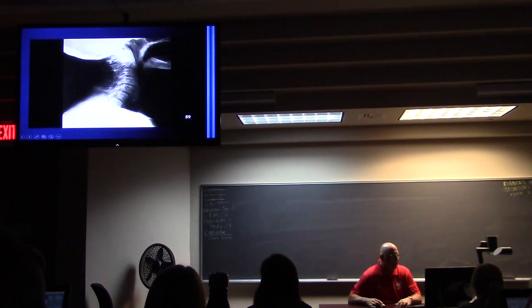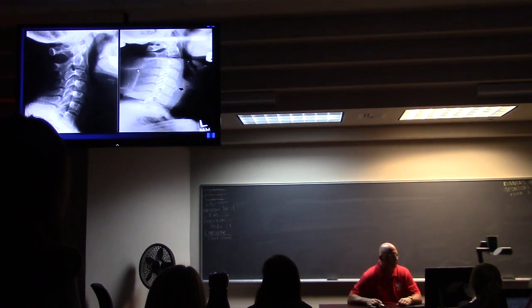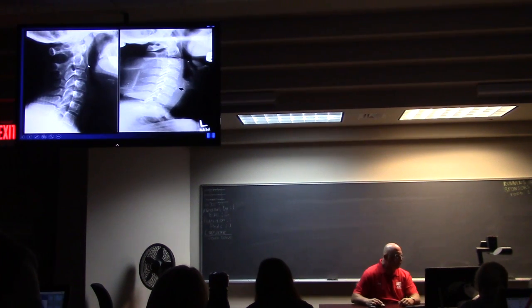This is a lady that was sent in to me from a chiropractor's office. He was manipulating her neck, and then he took the x-ray. See, she got a fracture here at C2. 2, 3, 4, 5, 6, 7. Anterior, posterior, spinal laminar, tips, soft tissue. There's a beautiful ring right there at C2. 2, 3, 4. It's that little teardrop fracture there.